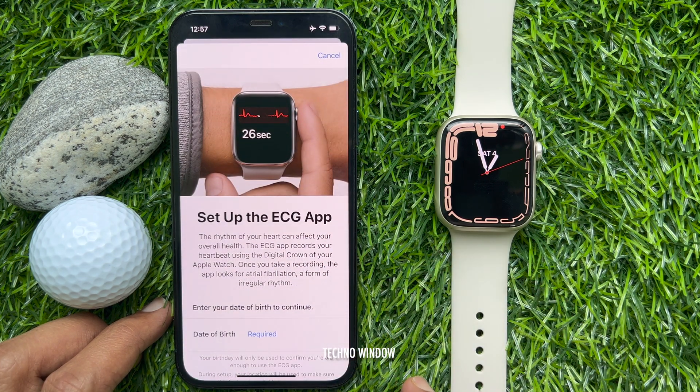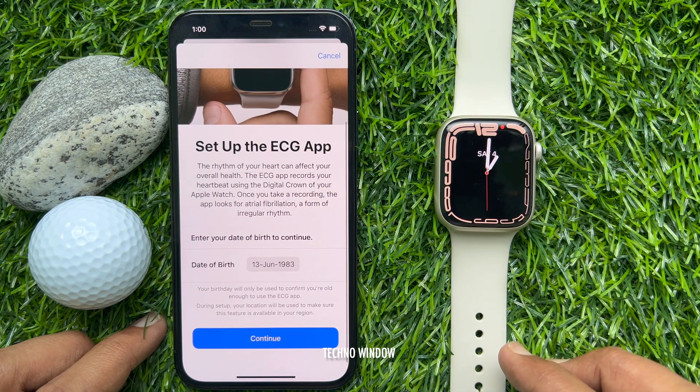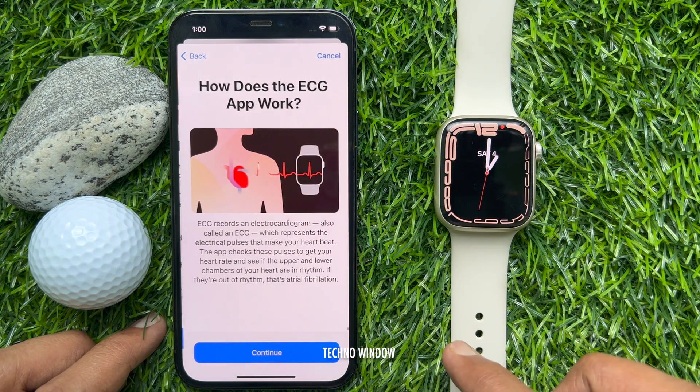Set up the ECG app. Date of birth is required. Enter your date of birth and tap Continue.